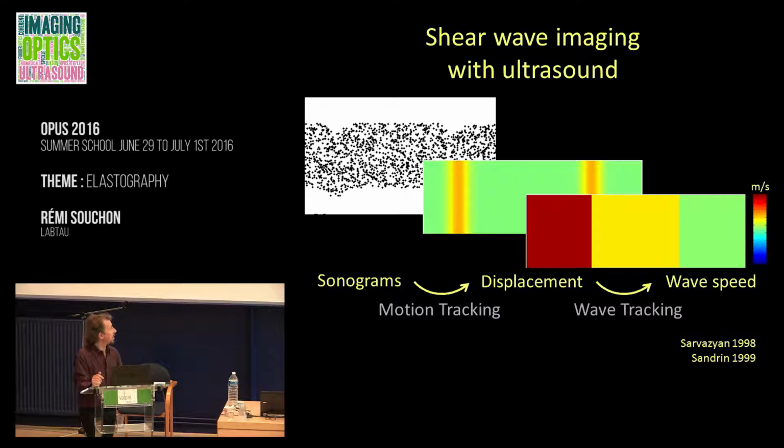You see there were actually 3 different materials in this image, so 3 different speeds: the central one being of medium stiffness, a very soft medium on the right-hand side, and a stiff one on the left-hand side. And now the new thing compared to strain imaging is that we have a quantitative scale. It scales in meters per second, because this is the wave velocity. And we can convert that to shear modulus if we want to.